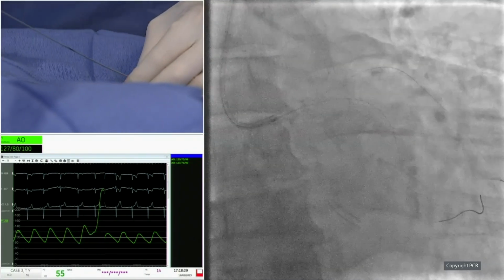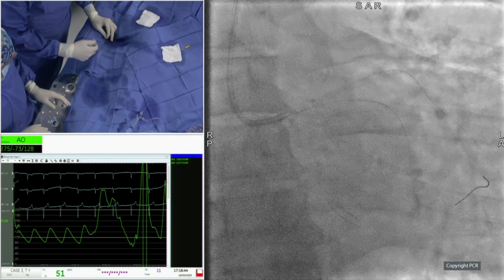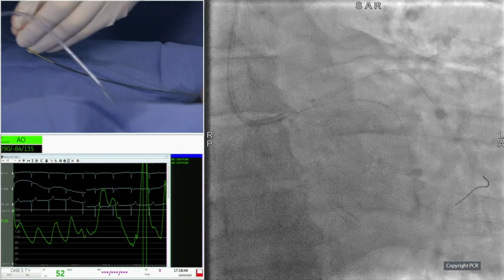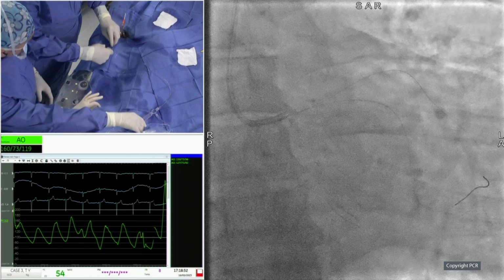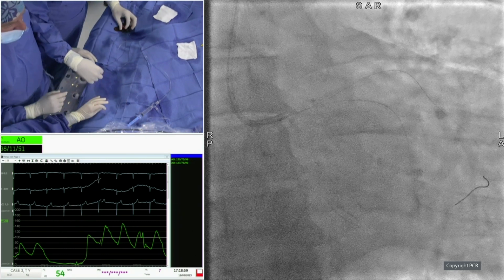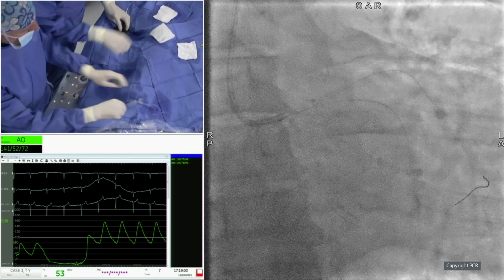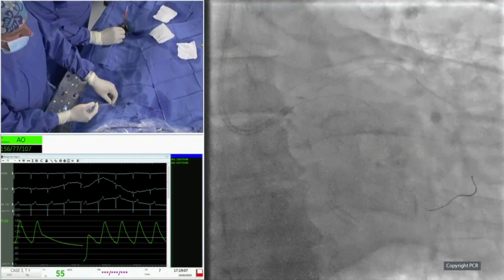Okay. So we will remove the balloon and then make an angio to see what is the actual effect. Normally, after the shockwave balloon, we go directly to the stenting. So we will see if nothing has been dislodged in the direction of the circumflex. That's really the question. ECG looks fine, so it should be nothing major, but you can always expect some mobilization of some calcified material.